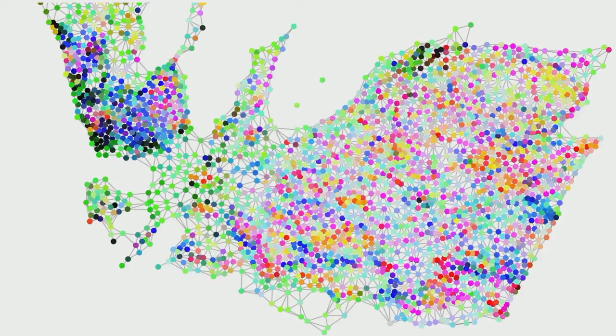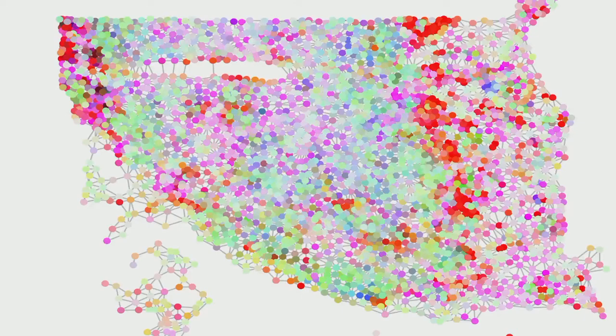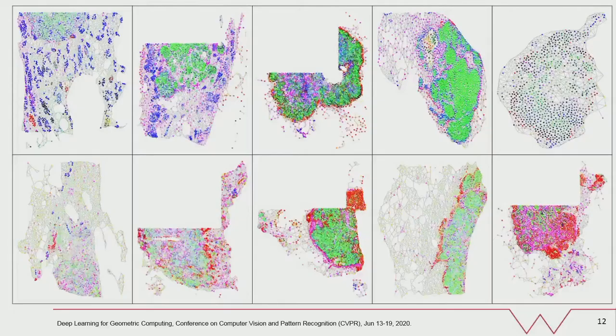Here you can see a whole slide level graph, or slide graph, with false coloring over nodes representative of their nuclear composition. As you can see, this modeling approach enables us to identify different types of cellular communities. Those are clusters in different groups you see on your screens, which enables receptor prediction downstream. Here is another slide graph. We found that slide graph allows good visual discrimination between positive and negative cases by showing different components or tissue regions that are active in different types of receptor positive or negative cases.